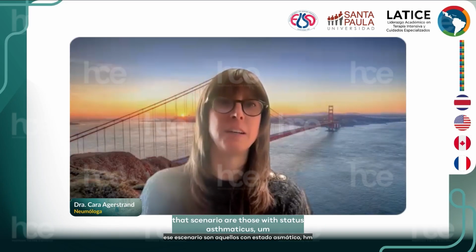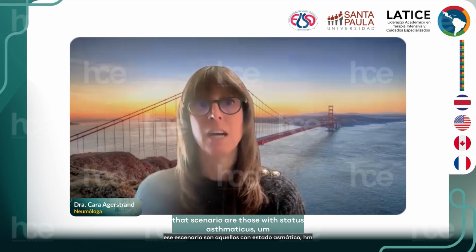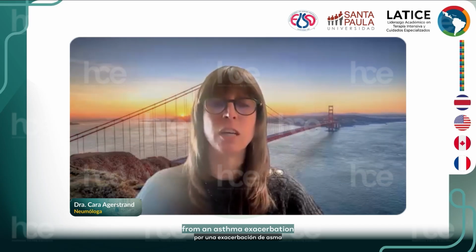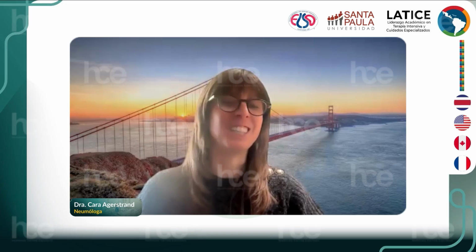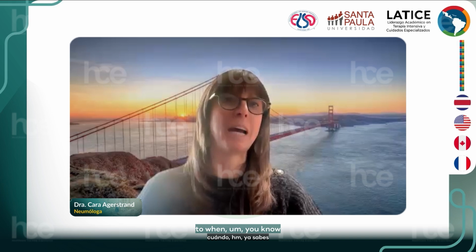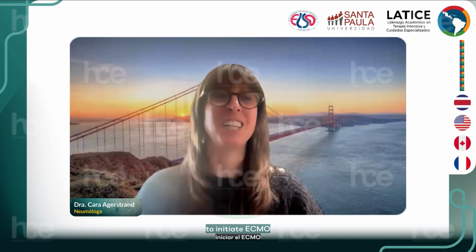There was a question about hypercapnic patients who do not meet ARDS criteria or clinical features of ARDS: when do you put them on ECMO? The most common patients we see in that scenario are those with status asthmaticus, those who have severe hypercapnic acidosis from an asthma exacerbation. Our initiation criteria are variable, frankly, because there's not a lot of evidence as to when to initiate ECMO.